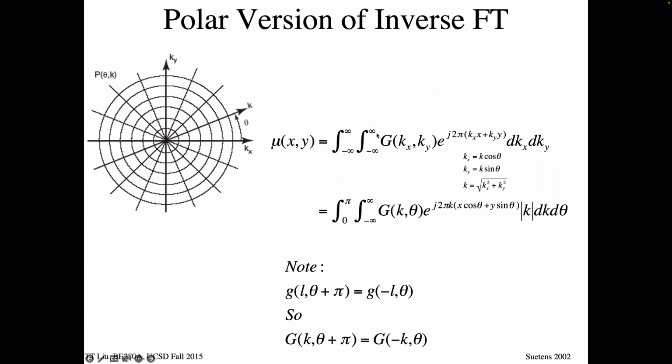And analytically, here's the Fourier transform of our image that we're trying to reconstruct. Remember, our image is the mu value, or the attenuation coefficient at each point inside the patient. And the Fourier transform of this function is here in spatial frequency space. It turns out we sample this when we do those projections with this radial technique, and so we get this set of radial samples through this function.